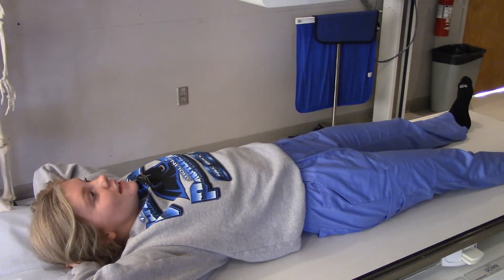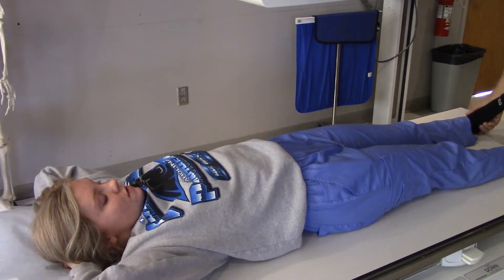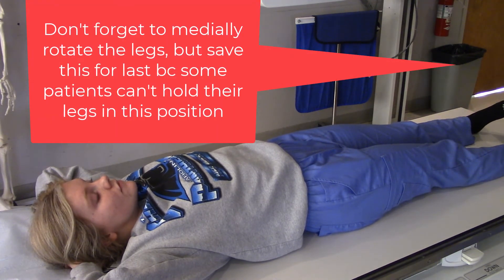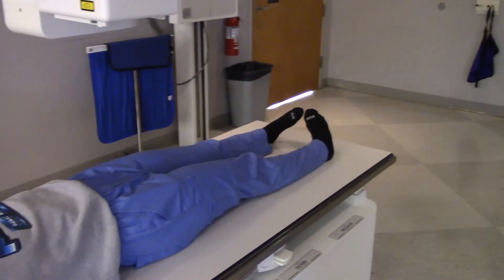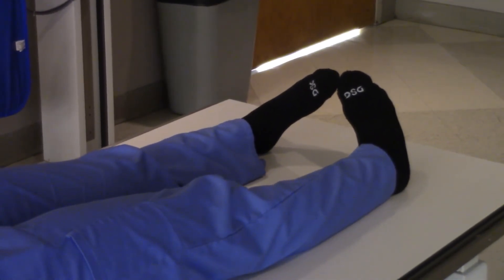I have a question — for supine, are our toes pointed in? Oh, we didn't do that — that's the part I always forget. So what we want to do is pigeon-toe those toes. Hold still so I can demonstrate for the folks back home. There we go — that's how the toes should be positioned for a pelvis x-ray.